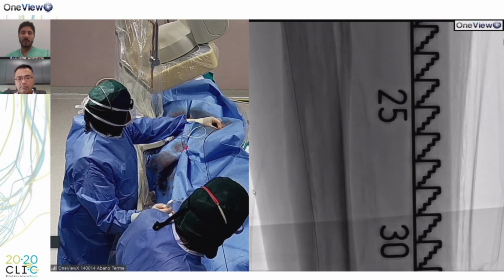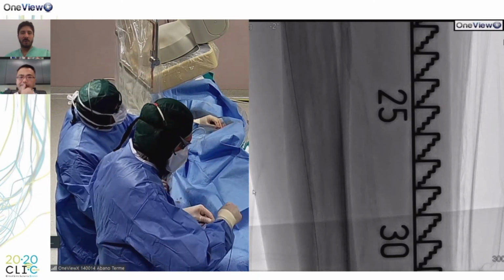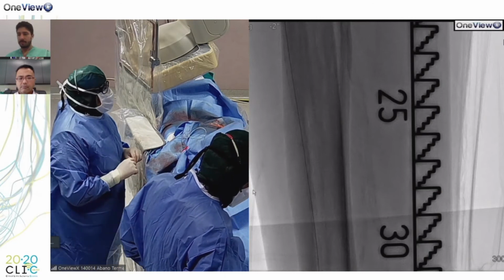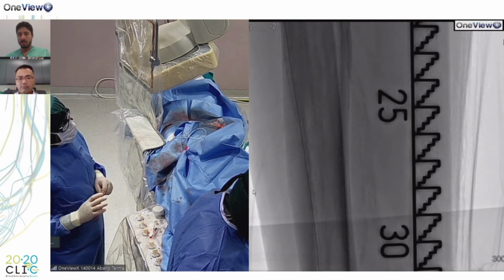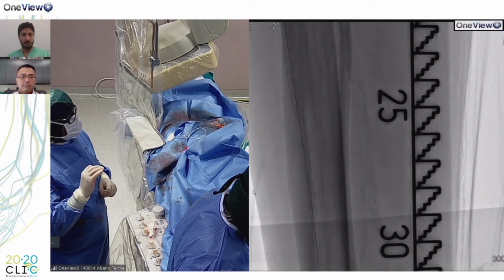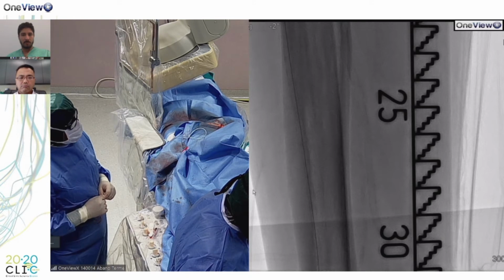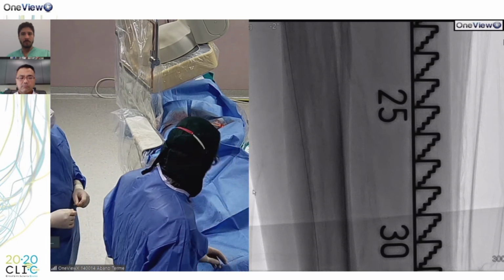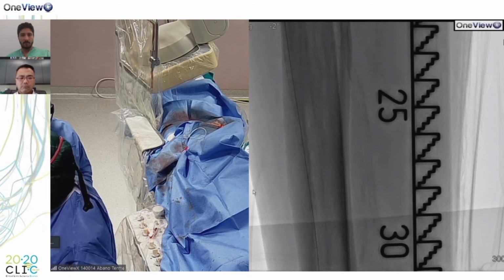Marco, did you perform some atherectomy also in the popliteal artery, or do you leave it? No. I think in the popliteal artery, for today I will go with a high pressure balloon, and then I will scaffold with a drug-eluting stent, because the lumen is quite tight, but not so tight for a rotational atherectomy. So I don't know if we could remove the plaque with the rotational atherectomy. I will try to crack the calcium plaque with a high pressure non-compliant balloon, and then probably I will decide to scaffold with the drug-eluting stent.